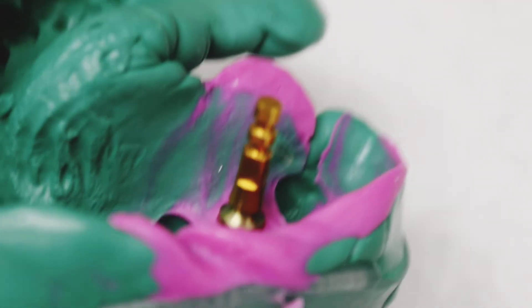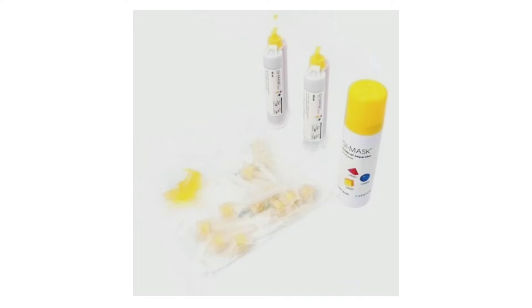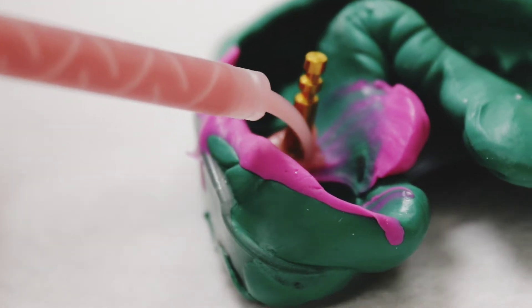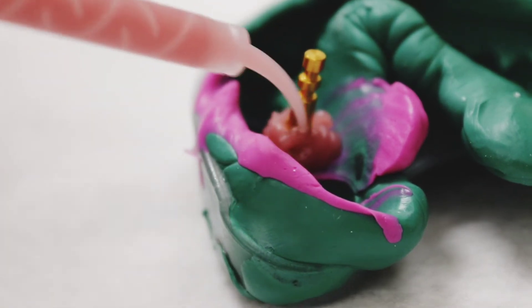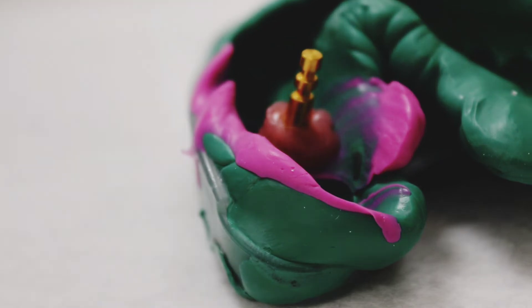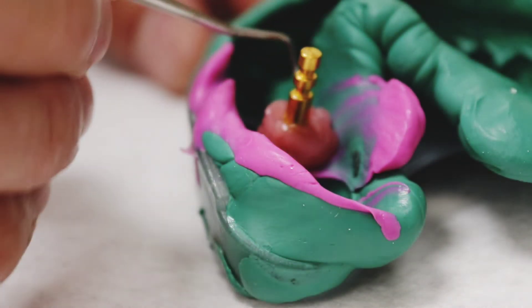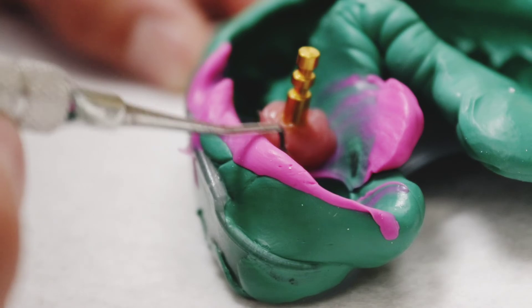Now we can do a soft tissue model. I use GI Mask — a soft tissue model material I use routinely in my office. It comes with a spray bottle adhesive, tips, and attaches to your impression gun. I go slowly around the periphery of the lab analog and impression coping, going mesial, distal, buccal, lingual. I make sure not to add any to the proximal surfaces of the adjacent teeth — you don't want that soft tissue material in there.